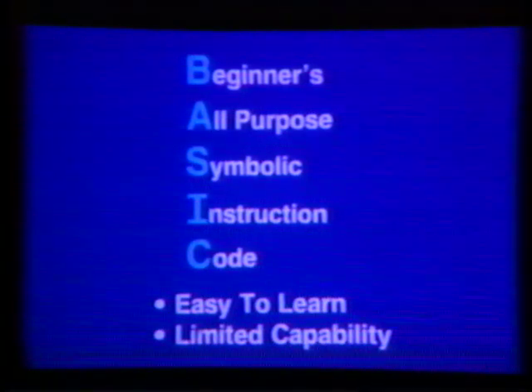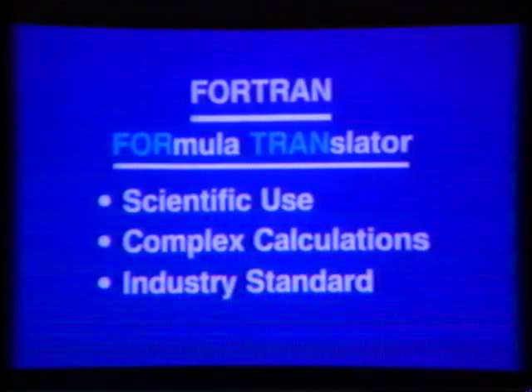Because it's a simple language, it's easy to learn, but suffers from limited capability. There are literally hundreds of different computer languages available. But in nuclear medicine computers, the most common language used is called Fortran, which stands for Formula Translator. Fortran was developed for scientific purposes and is very good for performing complex calculations.